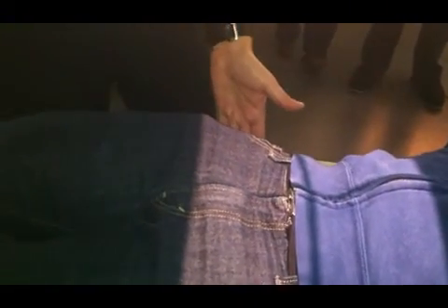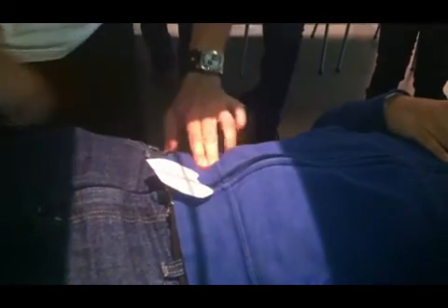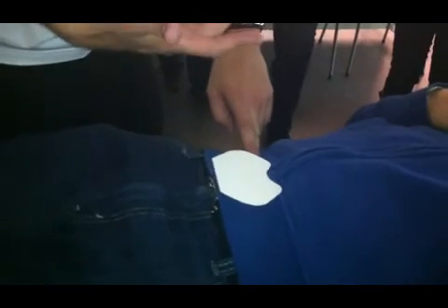So all you do is find the greater trochanter again. I'm going to rotate this in and out. Symphysis right here. That's where the bottom part of this border is going to be. You can check 2 spots: the bottom part where the symphysis is, or the top part, which will usually align with the ASIS. The ASIS is here, and you draw a line across there. The top of this shield should be just below that line, or butted up against it.